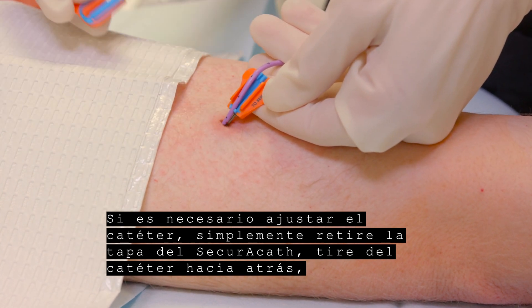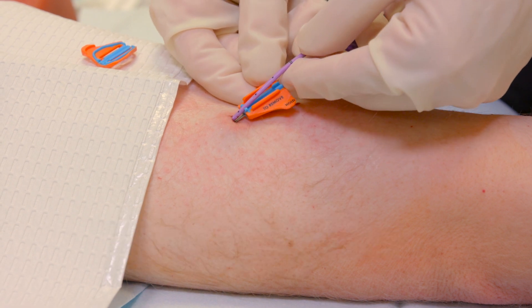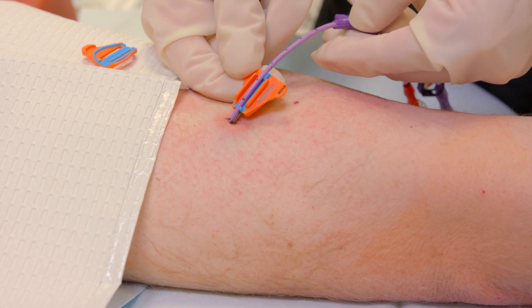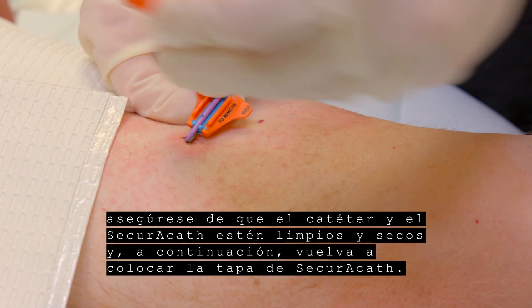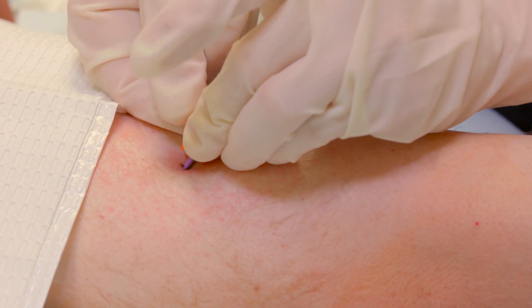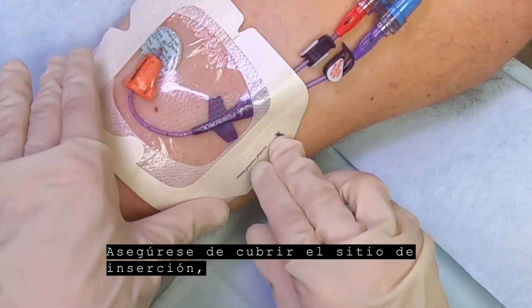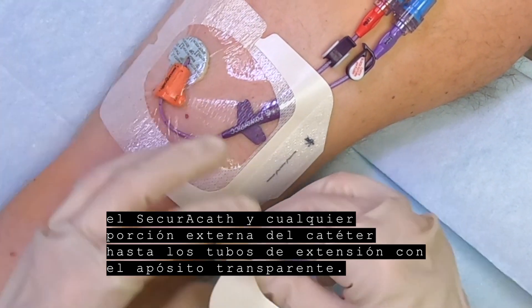If catheter adjustment is necessary, simply remove the SecuraCath cover and pull the catheter back. Make sure the catheter and SecuraCath are clean and dry, and then replace the SecuraCath cover. Redress per hospital protocol. Be sure to cover the insertion site, the SecuraCath, and any external portion of the catheter up to the extension tubes with the transparent dressing.